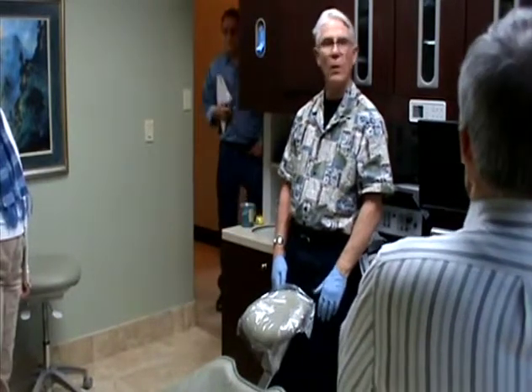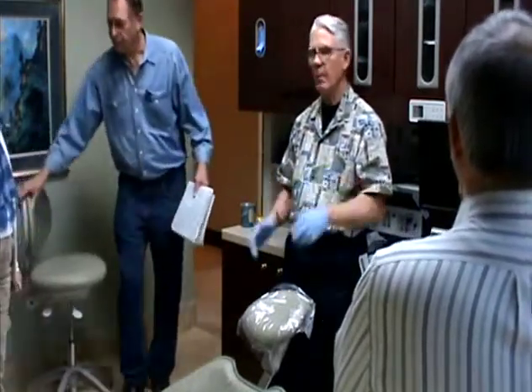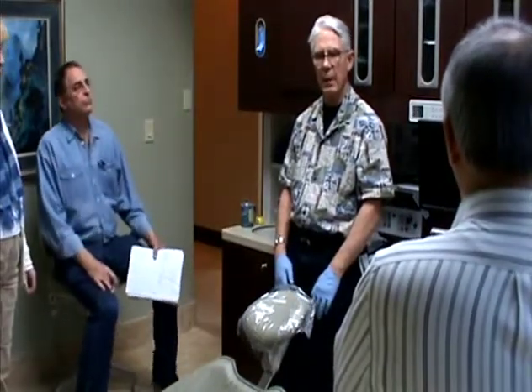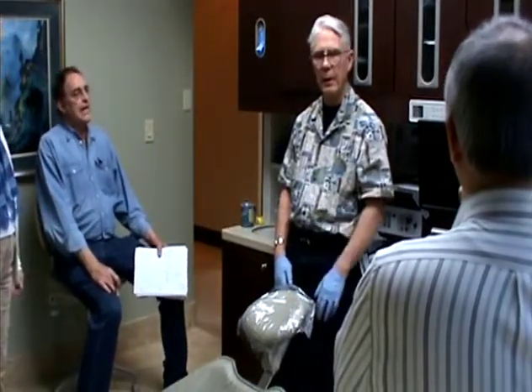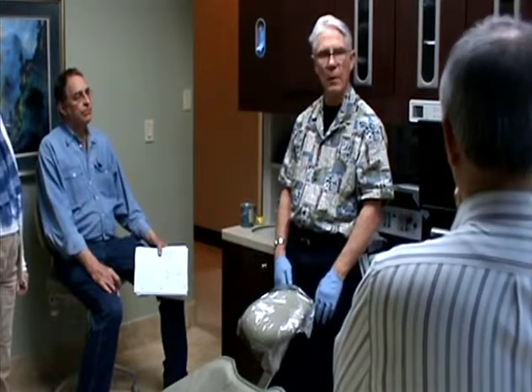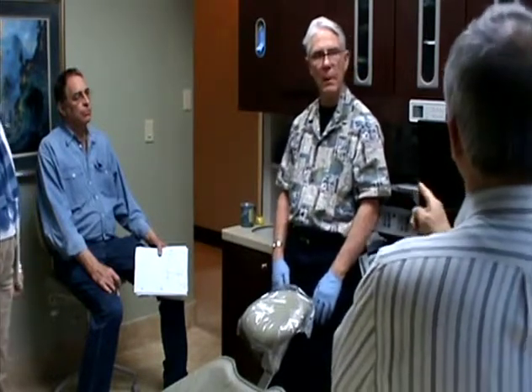She says, okay. So I arm reflex tested her, took all the measurements, made her an appliance, put it in, had her back the next week. She was translating, and I'd say 80% of her pain was gone. She was absolutely floored. Within a month, I had her back up on her toes doing ballet.